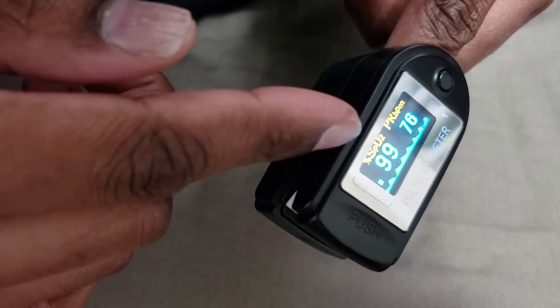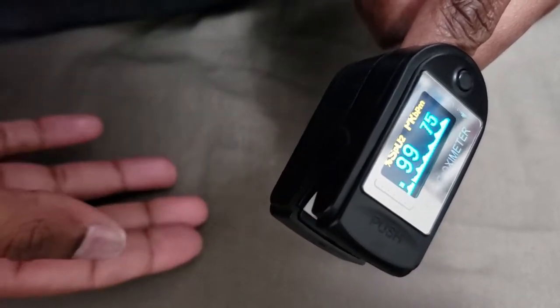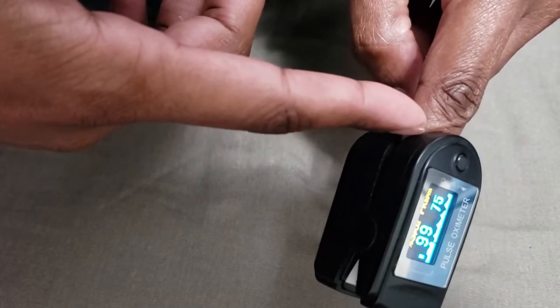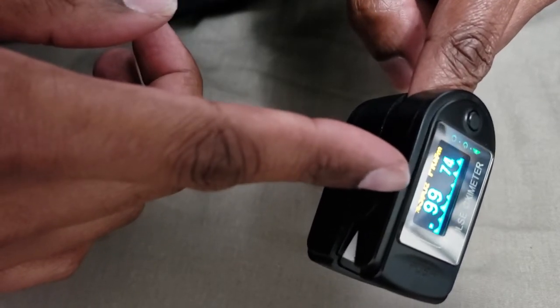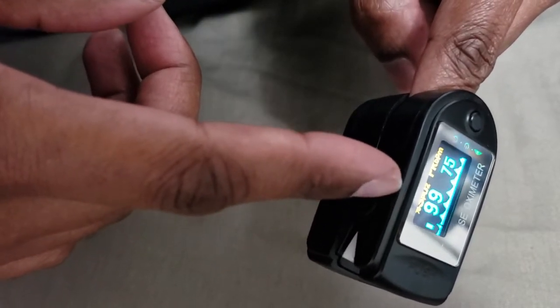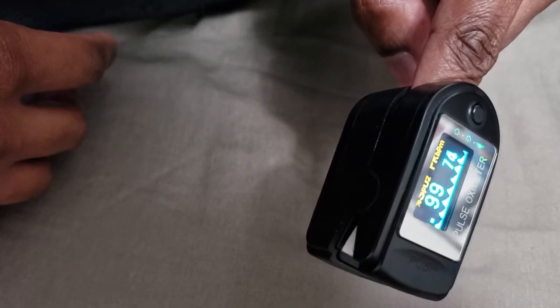So what happens with pneumonia is, since you're losing the capacity in your lungs to take in oxygen and therefore process it out to your body, especially like into your fingers, like say the blood in my finger, it would be getting less oxygen in that blood because I'm taking in less oxygen. So this number will start to go down. So if I'm feeling really congested in my chest, it might say, if it's usually 99 like now, and I'm sick, it would say 95 or lower, okay?